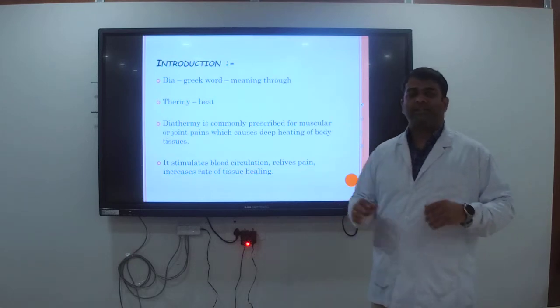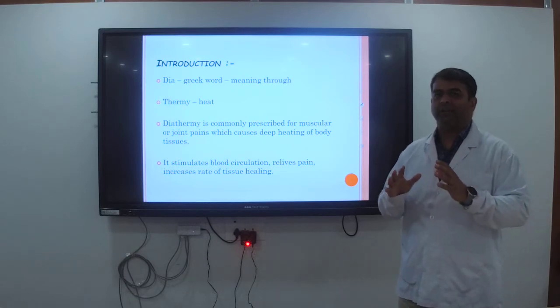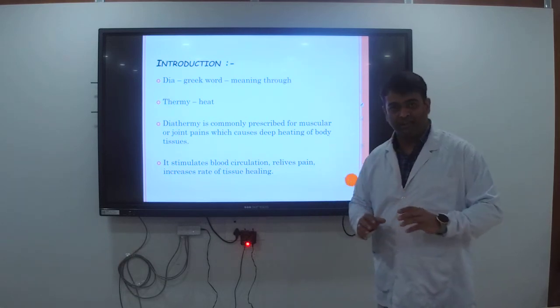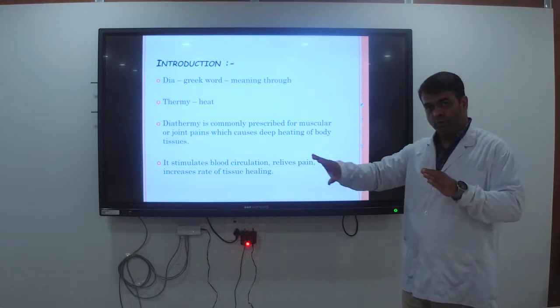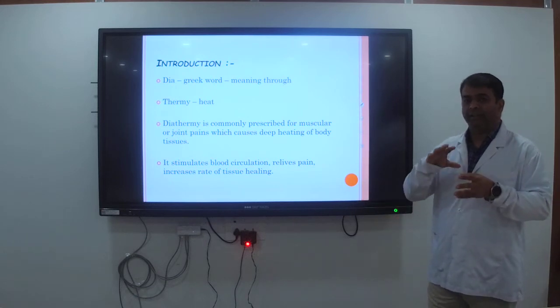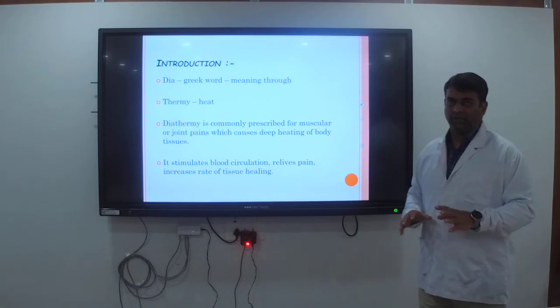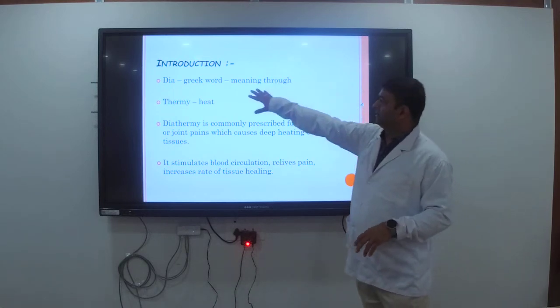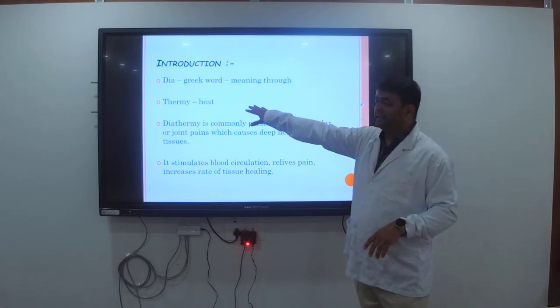Now SWD, that is diathermy. Diathermy is a combination of two words, where di is a Greek word which means through, and thermi, that you know, is heat. So the heat which is given through a medium is called diathermy. So di is a Greek word meaning through, and thermi is heat.